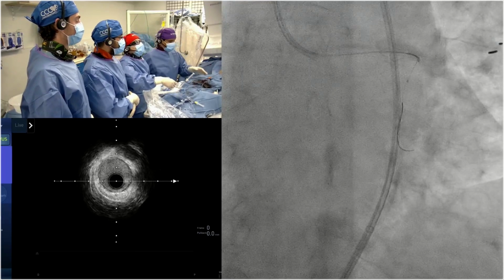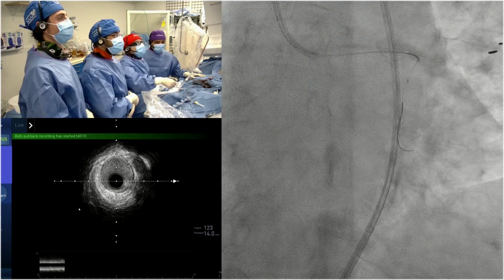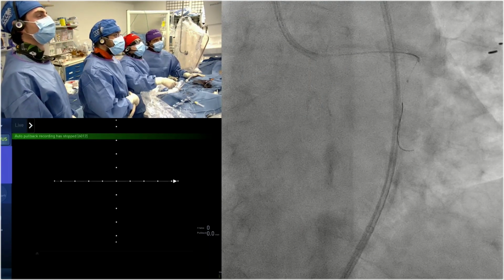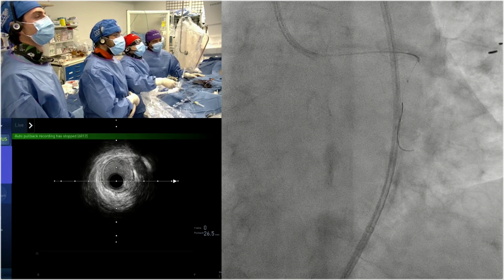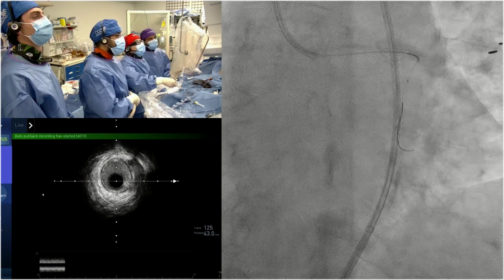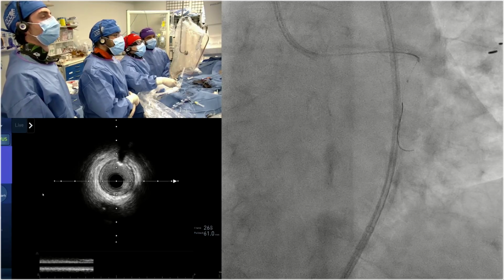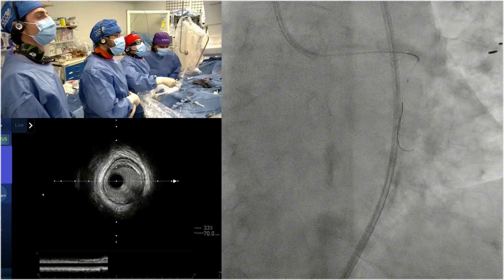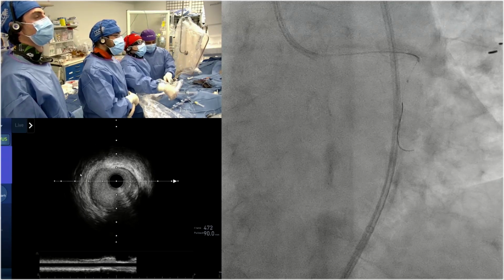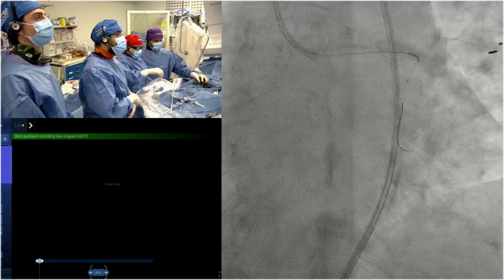Okay. But it's what you said, John. Not all cases are alike. That's exactly right, and that's the point. Exactly. I mean, there is a gray zone here. The deciding factor on the previous one was the pulmonary hypertension, primarily, even though most of the other factors are the same, excluding the AS, which you've already taken care of. No, I agree. I think the aortic stenosis, pulmonary hypertension, measuring hemodynamics before you do it, even though ejection fraction is normal, is critical. Here, listen, the hemodynamics were fine. Everything was good. Patient is preconditioned, doesn't have aortic stenosis. These people tolerate the procedure very well.